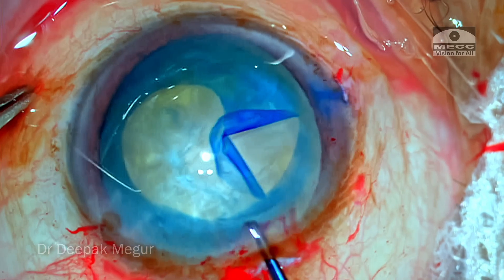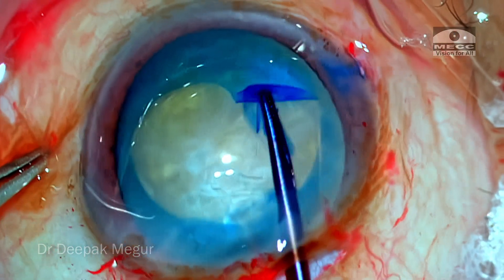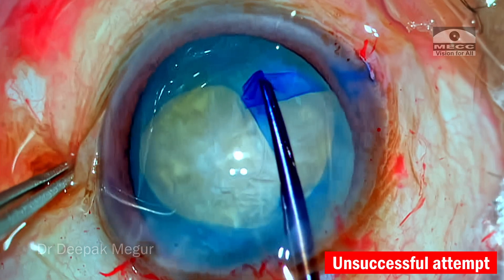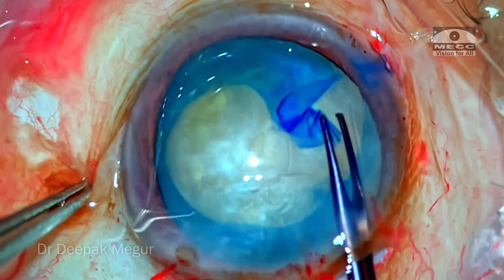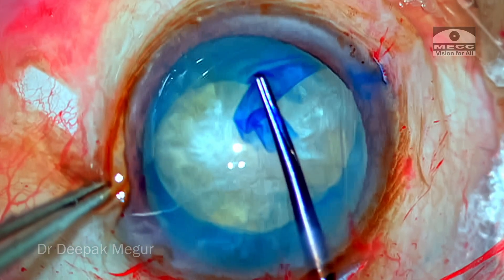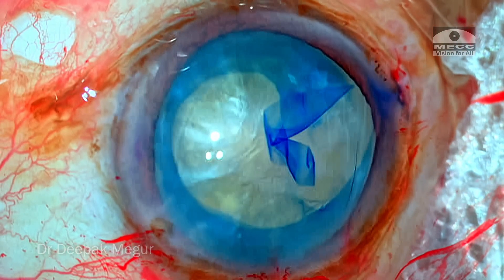The surgeon has now decided to use the forceps to pull the rhexis back in — he's going to try Dr. Little's maneuver. The thought of using the forceps is right, but let's see how the implementation is. There are a few unsuccessful attempts to grasp the flap first, and eventually the flap is grasped. However, it couldn't be retrieved back. Even though the forceps could finally grasp the flap, it was an unsuccessful venture. Eventually, the rhexis successfully went to the equator and it's very evident it has gone beyond the point of retrieval.